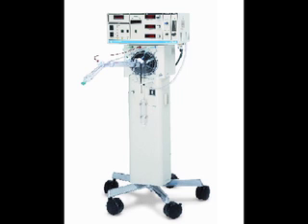Good morning and welcome. Today I'm going to go over the use of the Sensormedics 3100B oscillator on the adult patient. My purpose here is just to review the equipment with you so you understand what the knobs are, what they do, cover a little bit about the circuit, look at the blender, and finally the humidifier.